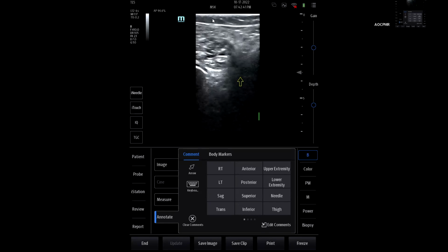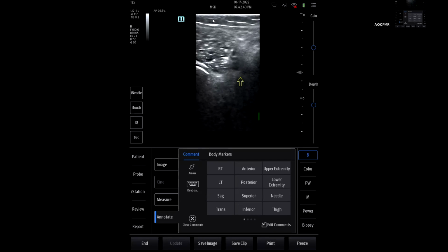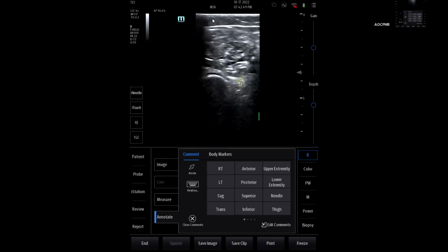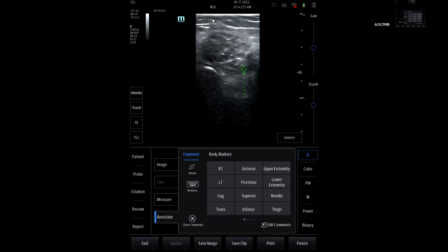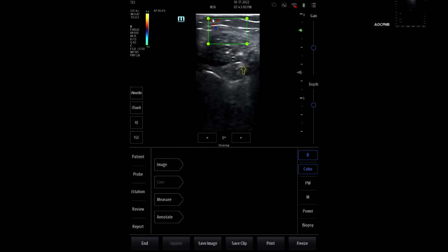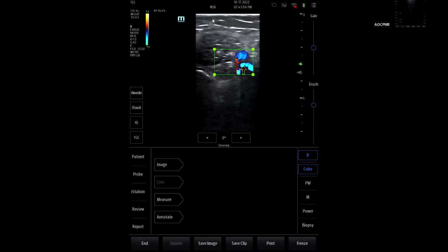In between, you'll see, depending on where you are, this is your tibial nerve. That arrow is pointing right to the tibial nerve, right there. Let's get a new arrow, right here, tibial nerve. If you followed this up, you would find the sciatic nerve. If you're looking for a tibial artery, if you're wondering if you're pushing too hard, it's going to be right next to the tibial nerve.